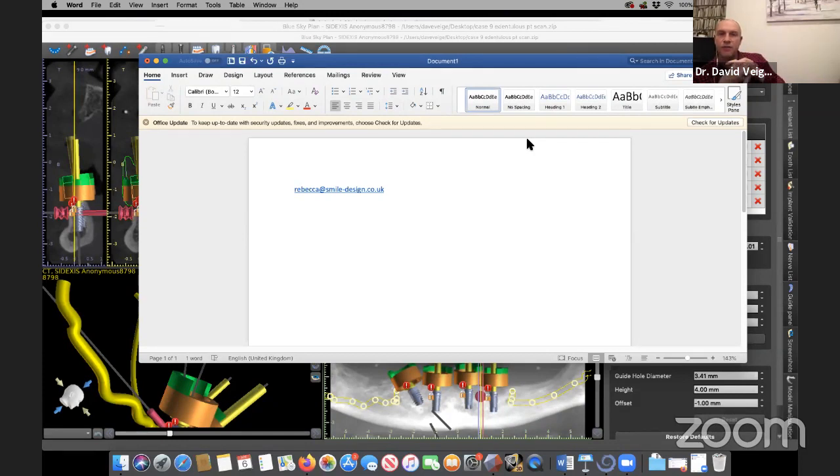For these angled abutments, how do you deal with bone on the distal? Great question. A couple of kits have very nice little profilers: you place something inside the implant, and then a burr sits over top of that and channels down that guide, which profiles the bone on the distal.